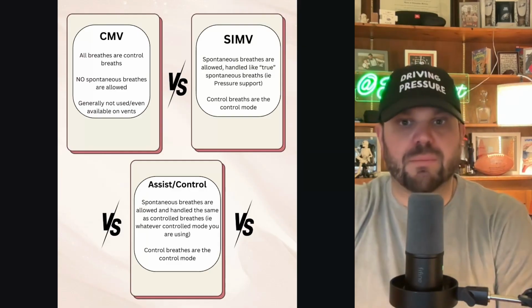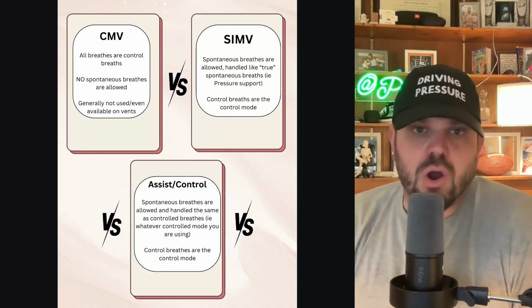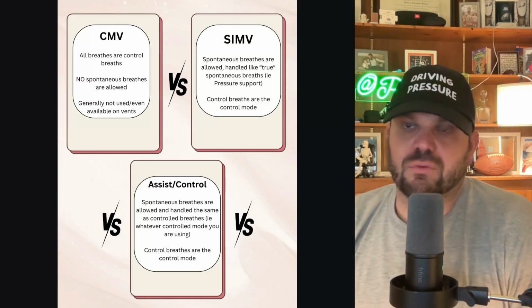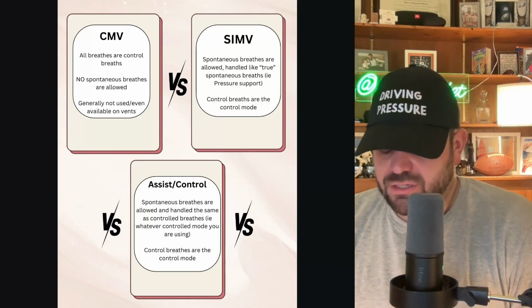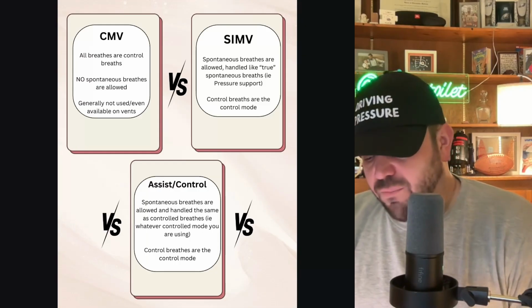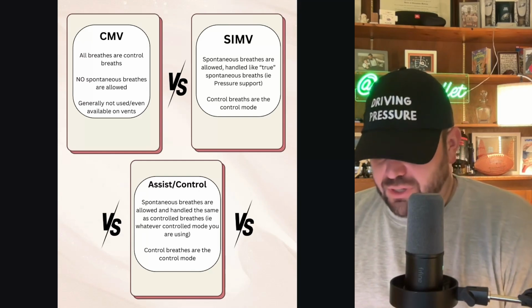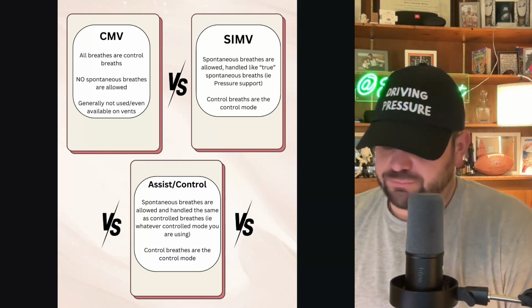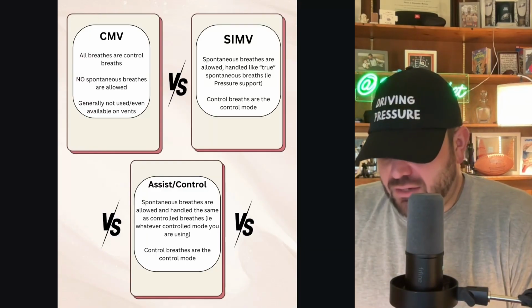And this didn't come up there, but this has come up a few times in the past couple weeks, and I wanted to just go over. I think it'd be easiest to do it this way because I didn't want to go back and forth on the socials. But what exactly is SIMV? Because SIMV, we know, is a terrible mode of ventilation, and we've gone through that, and there's plenty of research that supports that we really shouldn't be using it. But I think one of the issues is that it's misunderstood in the sense that people think that it's something that it isn't.